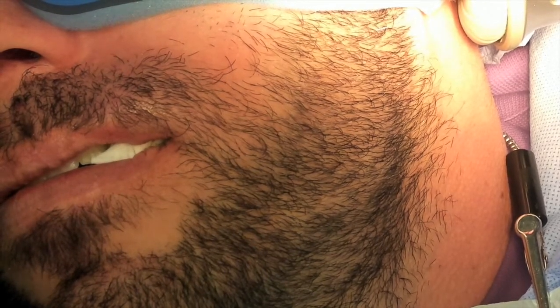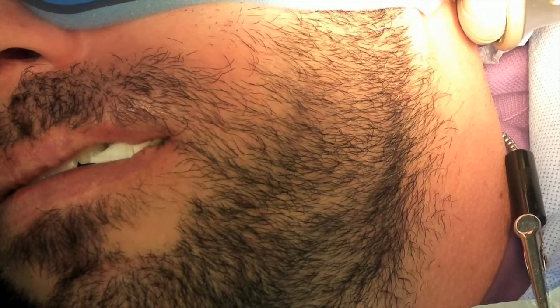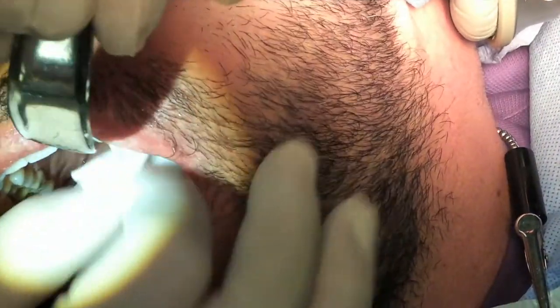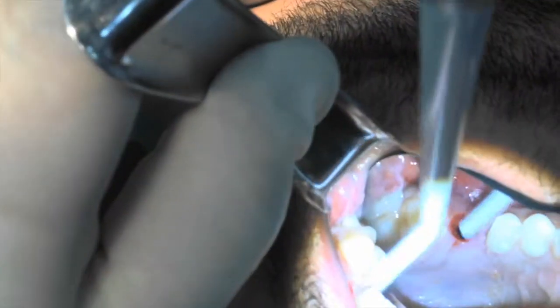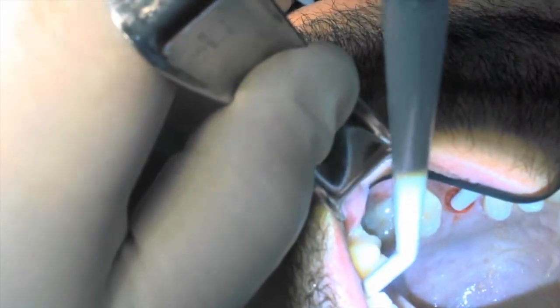And I've got my drill set at, I think recommendations are 40 newton centimeters. I set my drill at 45 newton centimeters. You know, Paul, not really the, always follows the rules. Yeah. All right, let's open that for me. Perfect. And in the site. So you can see the threads on the side of the osteotomy. Suction in, Nina. You can still see the floor, the roof of the sinus is right there. Perfect. Let me hit this for a second.